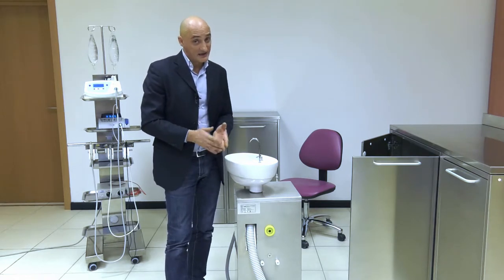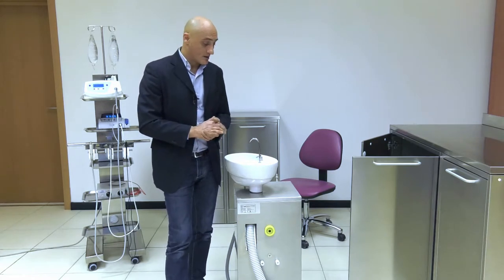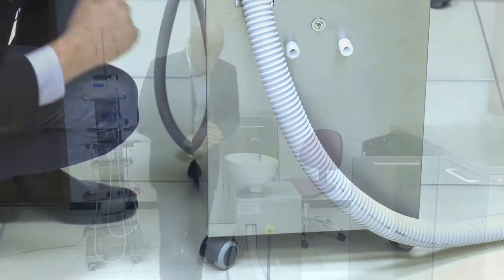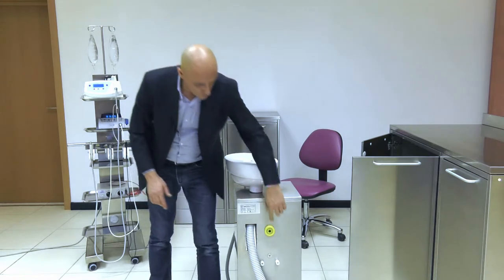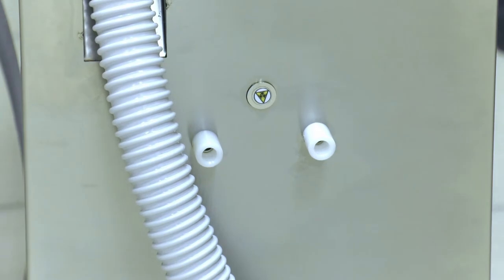This solution is also available with an amalgam separator, though the same issue applies — the cart will feature another pipe in the bottom section. As you noticed, this area features two white nozzle holders and a push button.